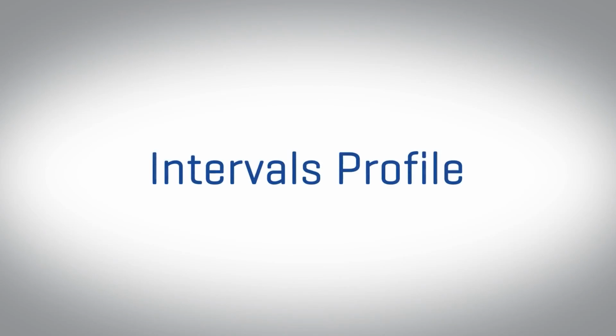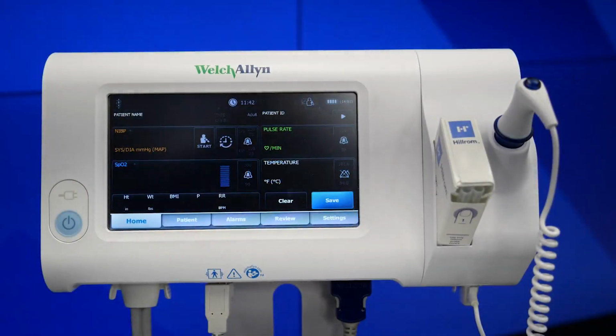Next, we'll cover the intervals profile. This profile is commonly used to monitor a patient for a defined period of time while treatment or care is being delivered. Unlike the spot profiles, intervals contains alarms which can be adjusted by simply clicking on the bell in any of the parameter tiles.